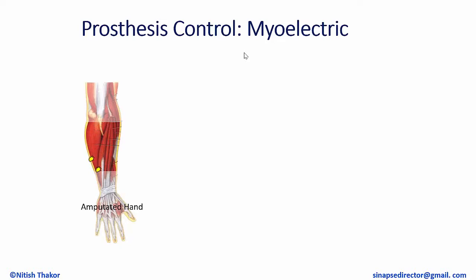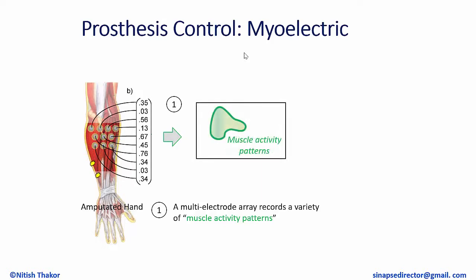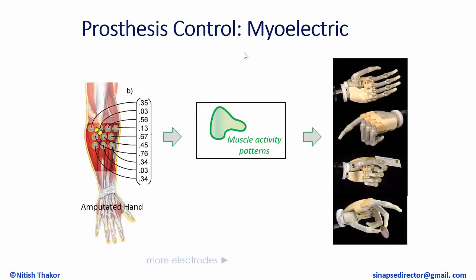Signals from the arm, which are called myoelectric or electromyogram, can be decoded or deciphered using a pattern recognition algorithm. From that, you can construct a variety of different patterns so that I can use those myoelectric signals to decode movement of an individual finger, or what's really more important, different types of grasps, like pinch or ball grasp, and so on. So that's the acceptable state of the art, and that's what I showed you in the first movie.